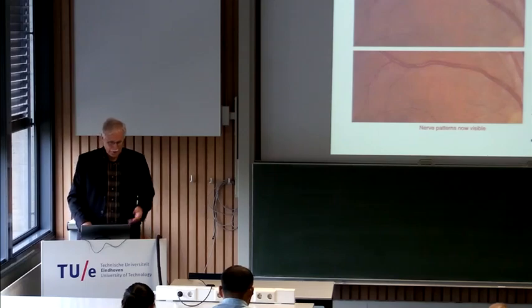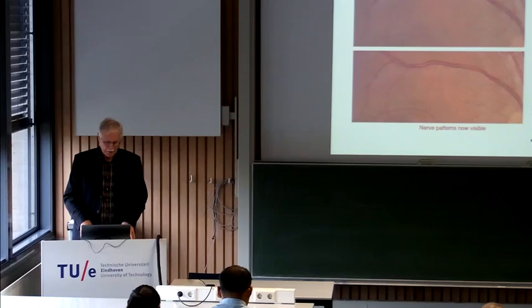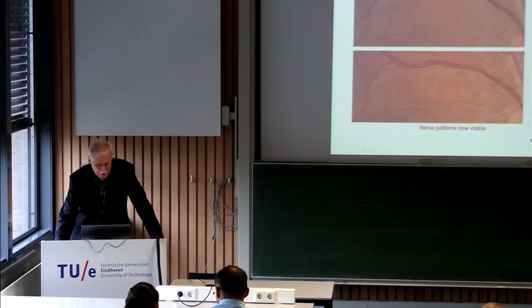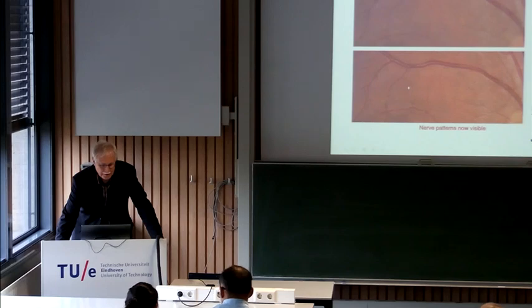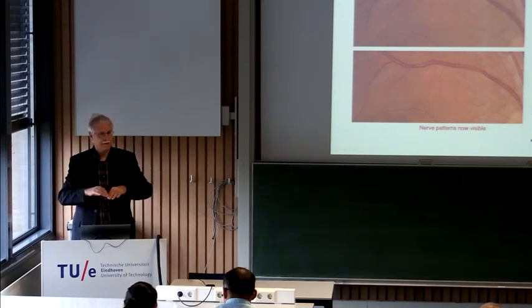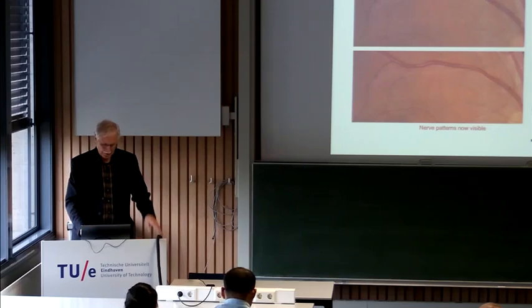We did de-blurring techniques. This was progressive blind deconvolution. So if your camera is not really sharp, we have seen that we have different ways to de-blur. And now what you can see is every cone and rod here, or receptive field, the ganglion cells, they have a fiber, or 1 million fibers going to the optic disc. And now finally you can see the fibers. So there's an incredible range of fibers running over your retina. You normally don't see them, but with the de-blurring you can see them. And some people have, of course, damage to the neuron layer.